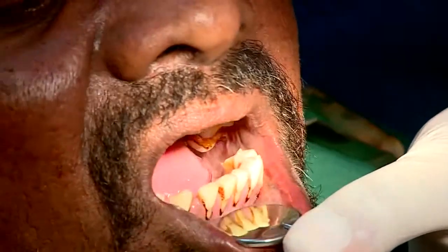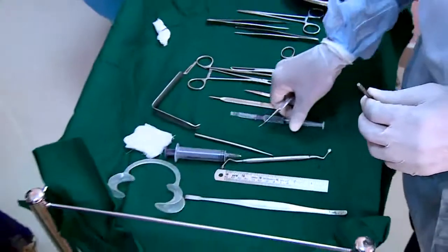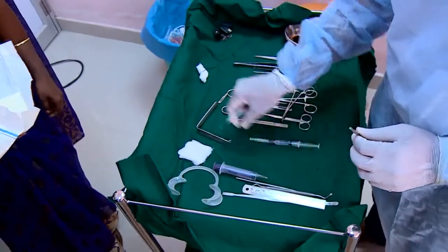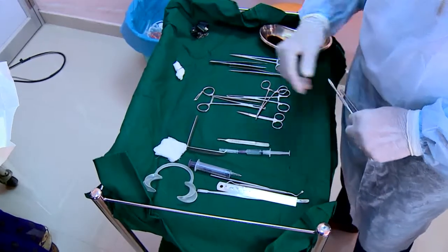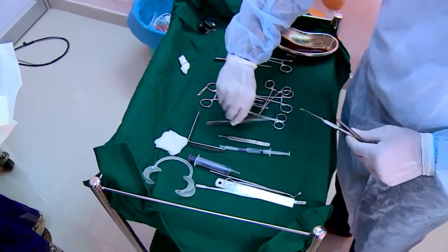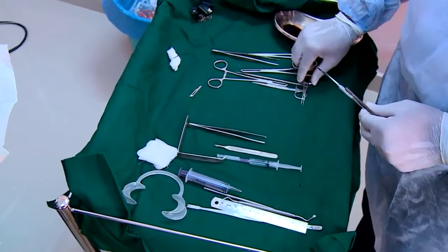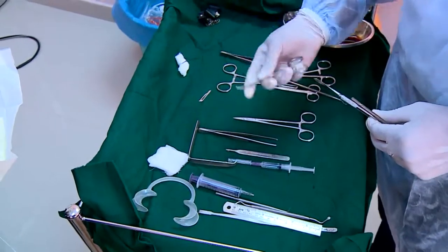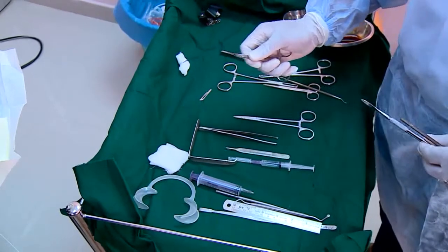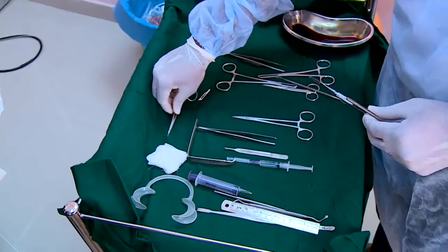So the armamentarium we are going to need: we are given LA already, so the LA is over. Then we are going to need a good retractor. To start with, we need a BP blade and a handle, and a tissue forceps. Following this, we need to close the wound, so we will need a needle holder. Apart from this, we may need an artery forceps or a mosquito if we find some bleeding arteries, to clamp them and stop the bleeding.